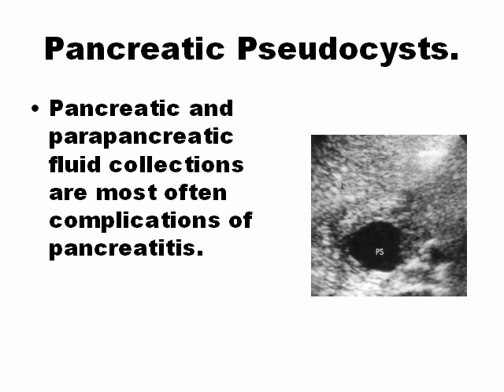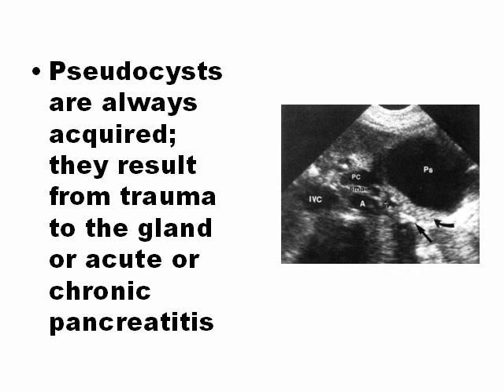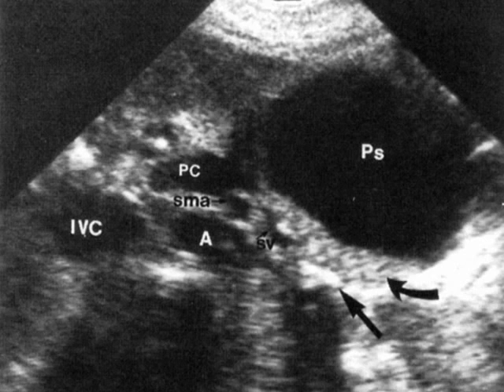Pancreatic pseudocysts are the most common complication of pancreatitis. Free fluid is another form of complication. Pseudocysts are always acquired — they can result from trauma of the gland or acute or chronic pancreatitis. In the picture you can see a pseudocyst that is anechoic, but the borders are not as regular as a true cyst. Sometimes inside the pseudocysts you can see echogenic parts.